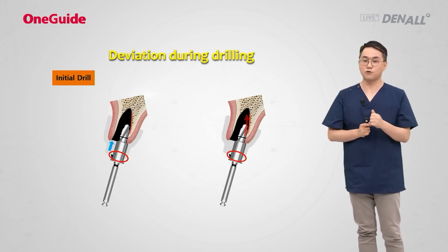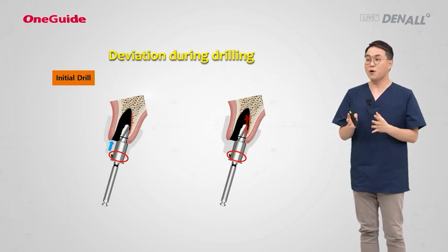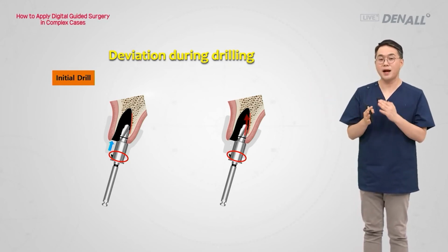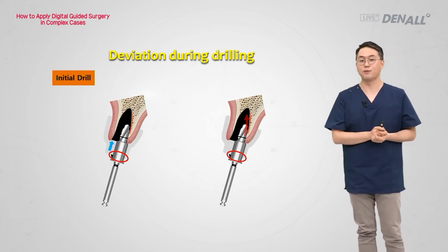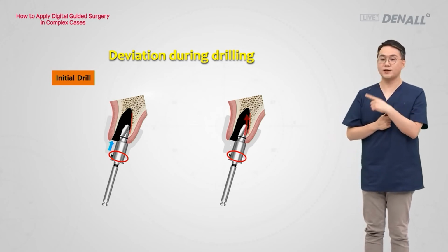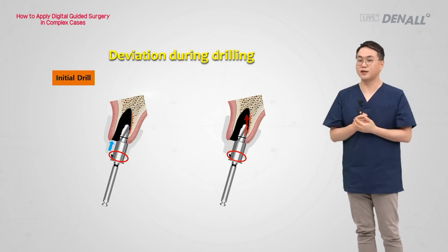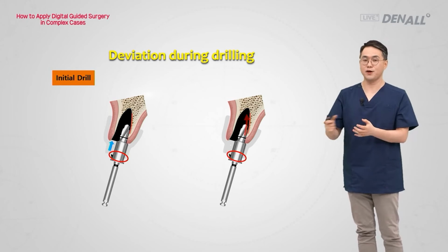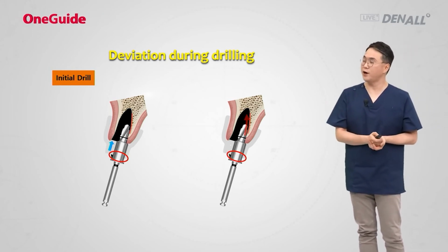If the drill is not driven anymore and it is pushed, you need to realize that the initial drill side wall touches the palatal wall of the extraction socket at the upper anterior, but there was no solution for it in the past. So we made an indentation on the palatal with the side cutting and tried the initial drill again, which was cumbersome. Just to do the guided surgery, we need to prepare the taper kit or side drill.